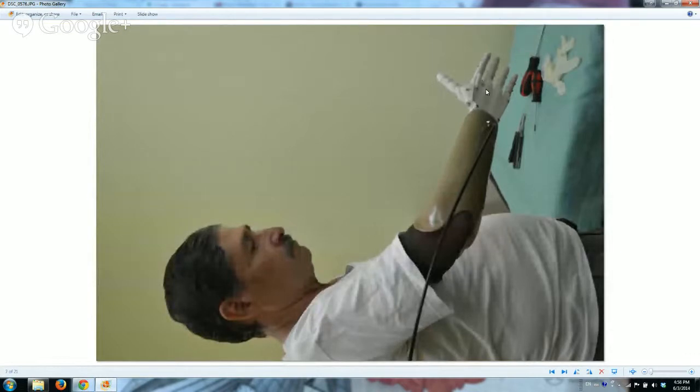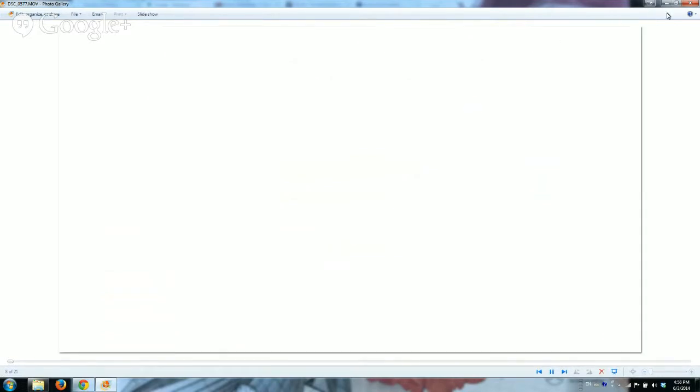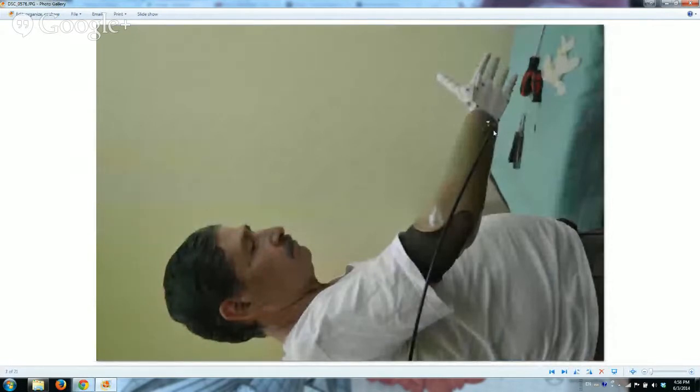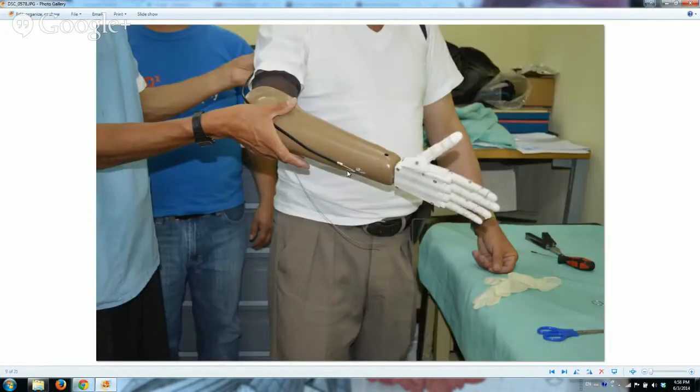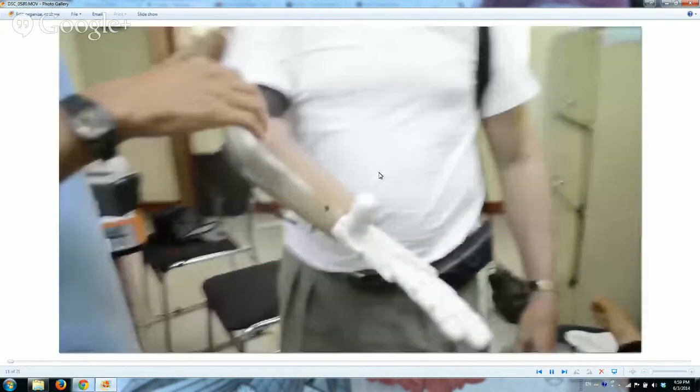This is the 3D printed hand. You can see there is a bicycle cable — one of the first things we wanted was for it to be very simple and very reliable, with low cost. This is under $50. The hand is 3D printed and the stump goes inside this socket, and that's where he puts his arm stump. We have some videos of him actually using it.